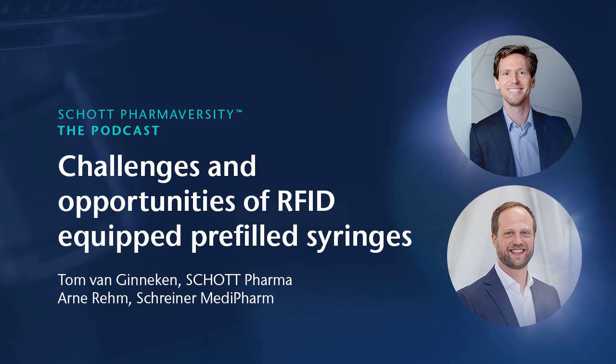During the fill finishing of the syringe, the pharmaceutical company can write all the relevant drug, batch, concentration, and production information onto the chip. Because every syringe needs to be labeled, there is no additional effort needed at the pharma company. There's no additional process step needed. The only extra effort is that inexpensive RFID reading equipment would need to be installed, both in the pharma production process as well as in the hospital.